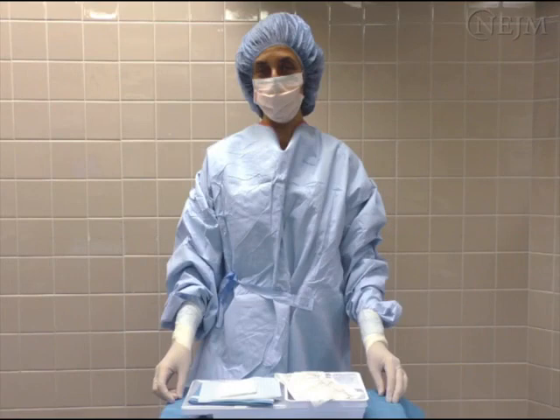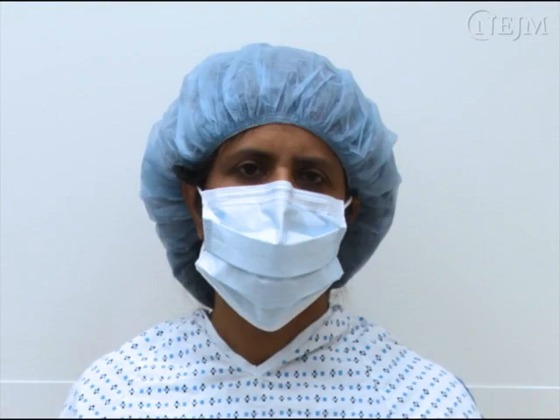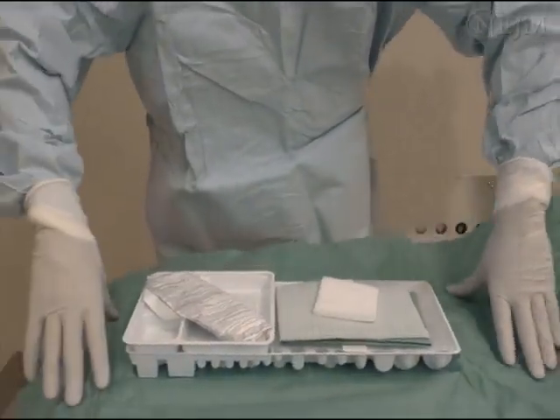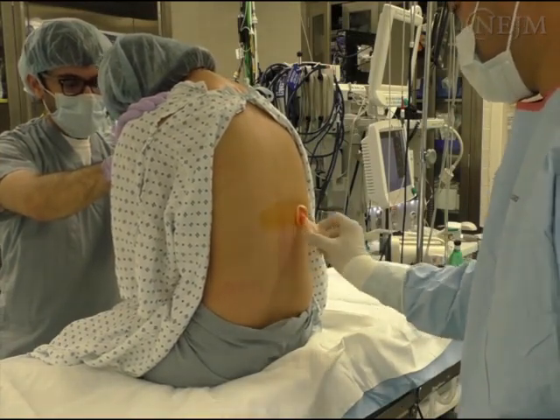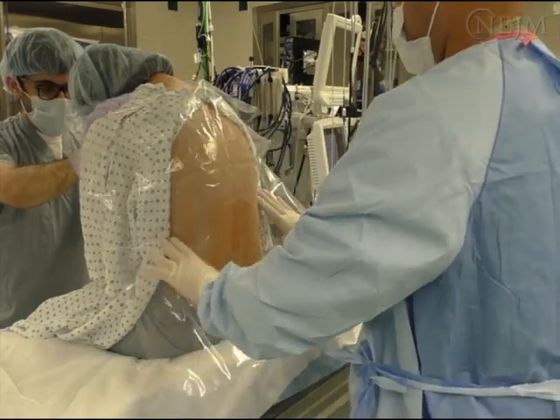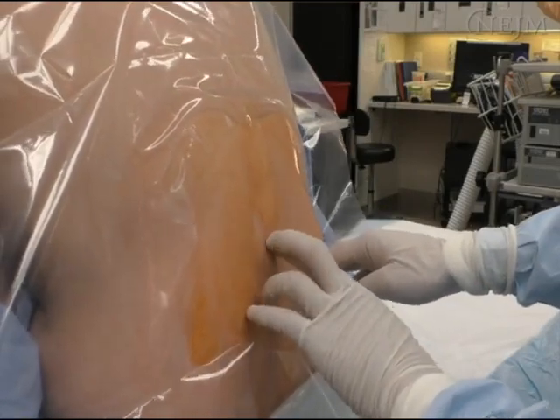Sterile technique is very important for this procedure. Don a mask, head covering, and sterile gloves, and adhere to your institution's policy regarding a full sterile gown. The patient and anyone else in the room should also wear a head covering and mask. Open the sterile epidural kit and organize the contents for ready access. Use the filter needle to draw up the medications. Apply the antiseptic skin cleanser in a back-and-forth motion for approximately 30 seconds and allow the solution to air dry for at least 30 seconds. Place the sterile drape over the patient's back with the opening providing access to the planned site of catheter placement.